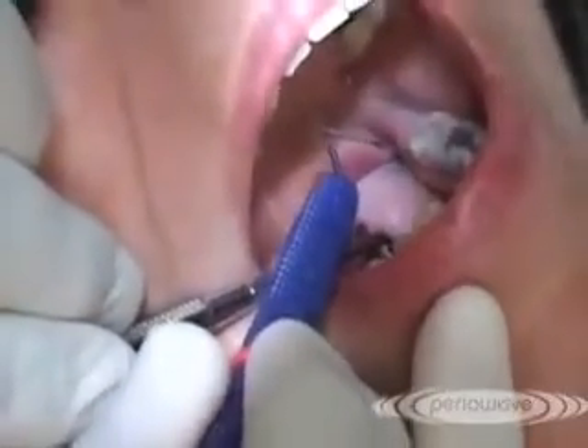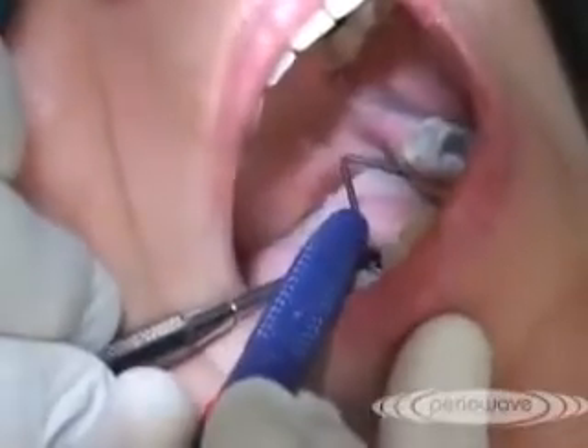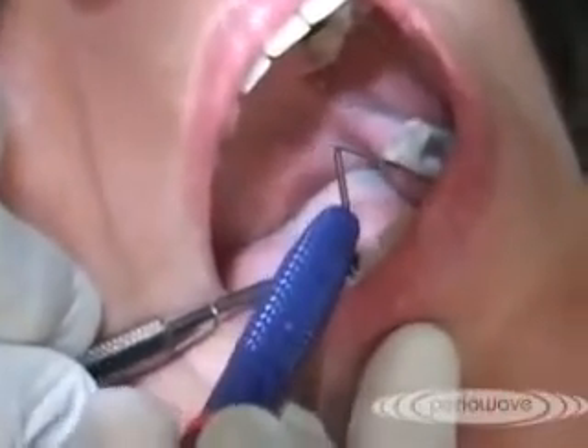The use of the PerioWave system as a pre-treatment is an additional benefit that will allow you to improve the overall level of periodontal care.